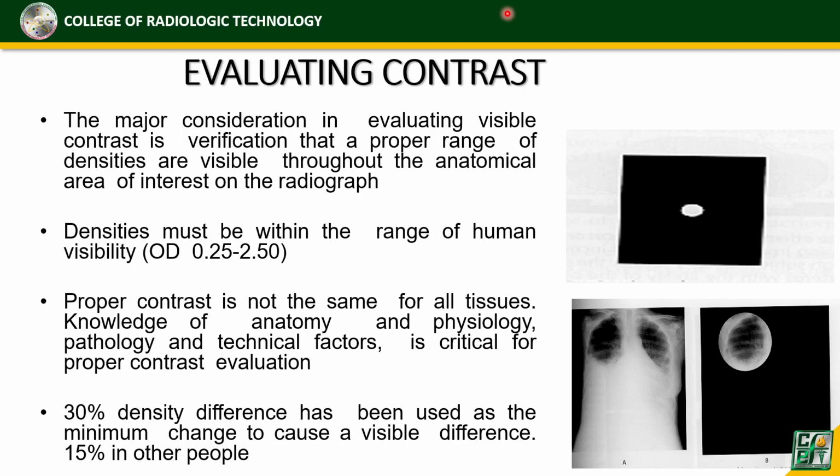Proper contrast is not the same for all tissues. Okay, so we should remember that. Okay, bakit? Kasi dapat we are knowledgeable in anatomy and physiology as well as pathology. There are considerations in the manipulation of contrast of technical factors kapag may pathology na na-involved.